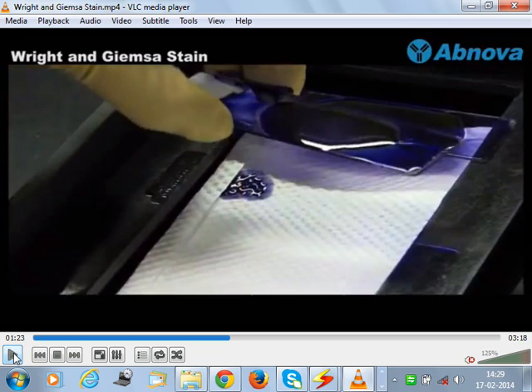So you have to prepare 3 slides. One for 7 minutes, one for 8 minutes, one for 9 minutes. Because different slides will look differently under different staining situations. And we'll see which one comes out nicely. Now, the examiner will ask you what is happening during this period when you are adding distilled water.